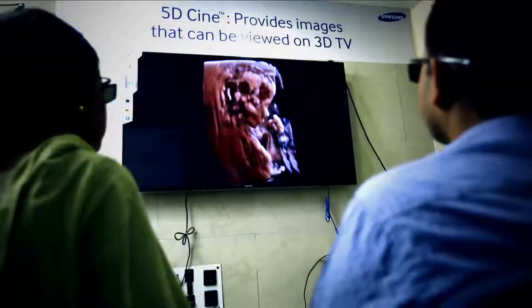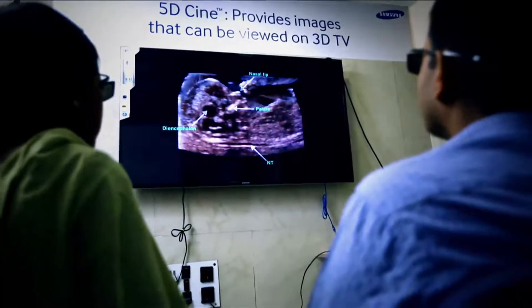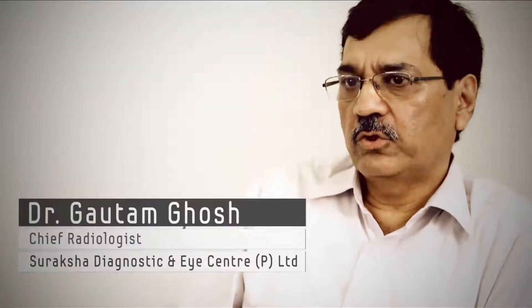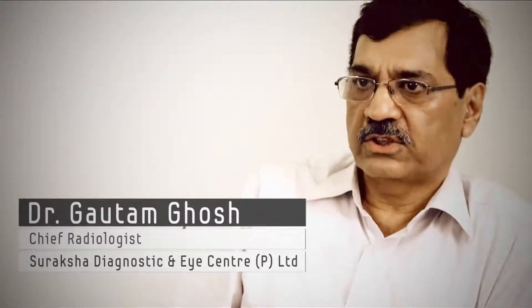They have added that this 3D can be transferred onto a big LED screen where the patient party — if it's a pregnancy case, the parents; if it's a tumor you are dealing with, the surgeon — anybody else can watch it in 3D and get a glimpse of it. The major use would be if a surgeon sees a tumor from all three dimensions, so he can plan a surgery better. You are so confident that what you are seeing is actually what is happening there — that is the critical aspect.